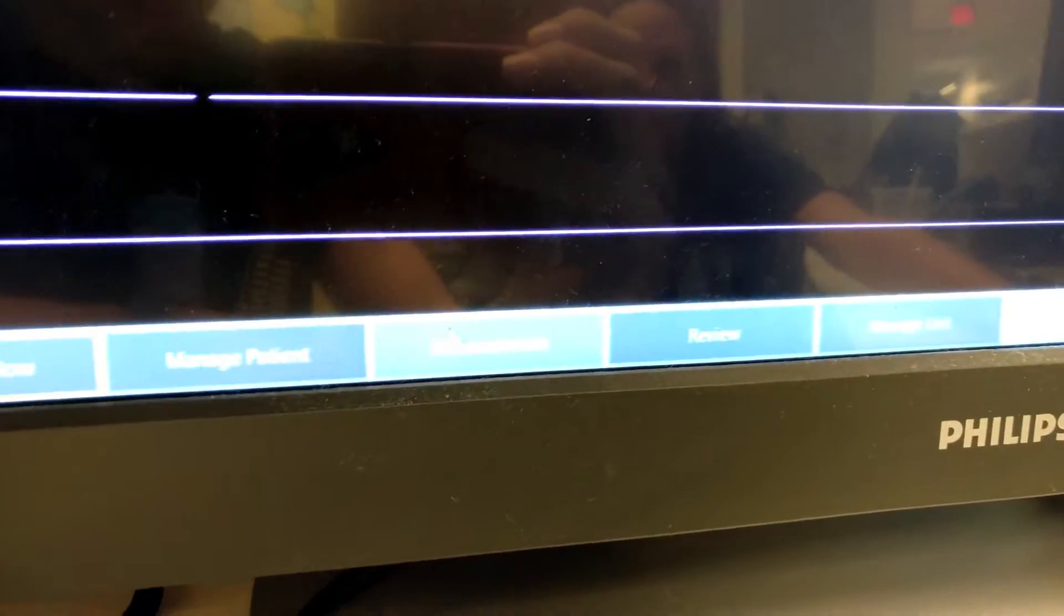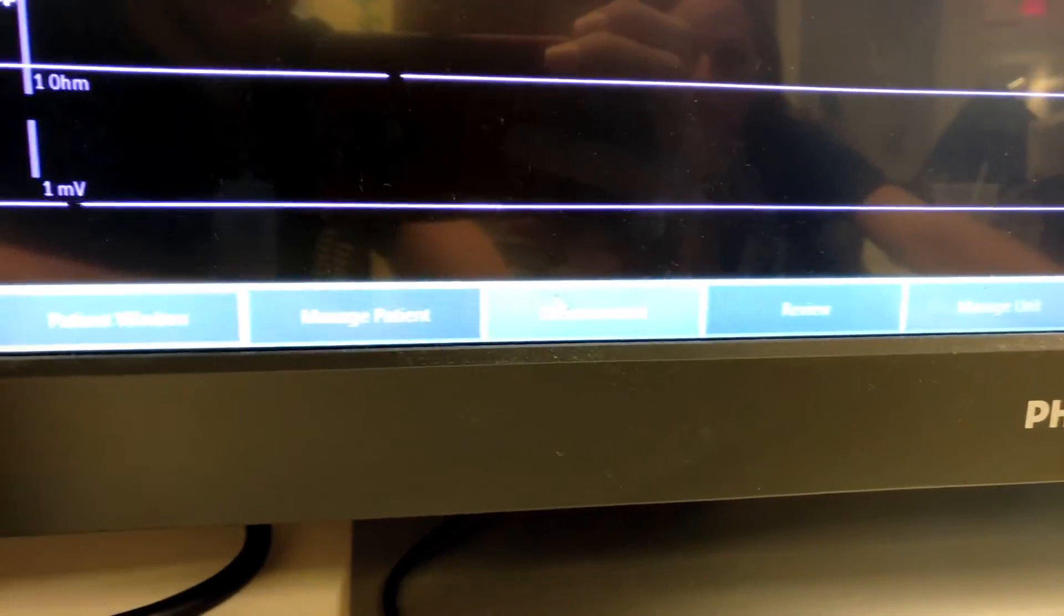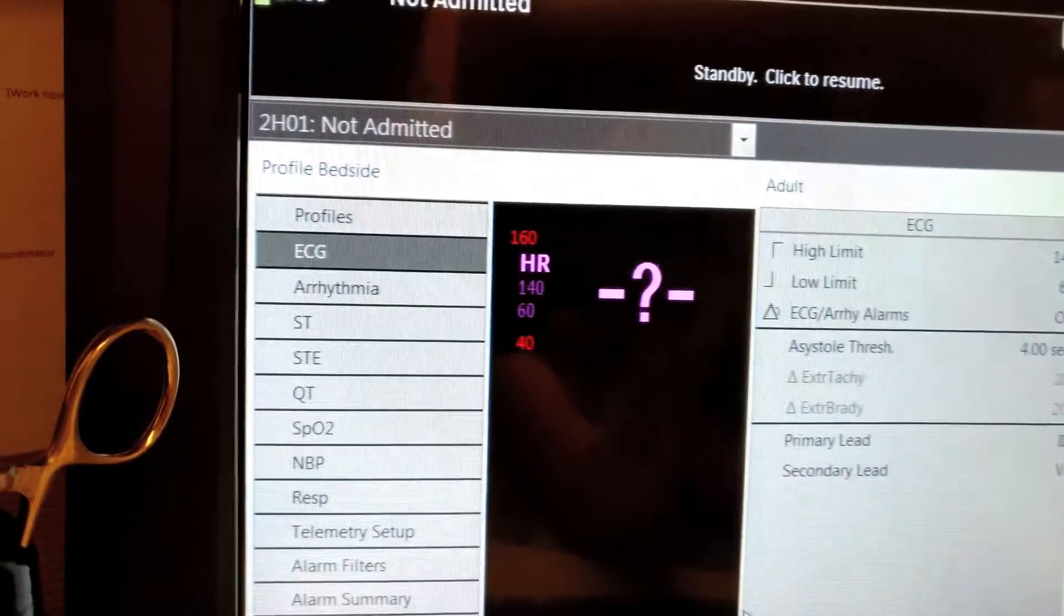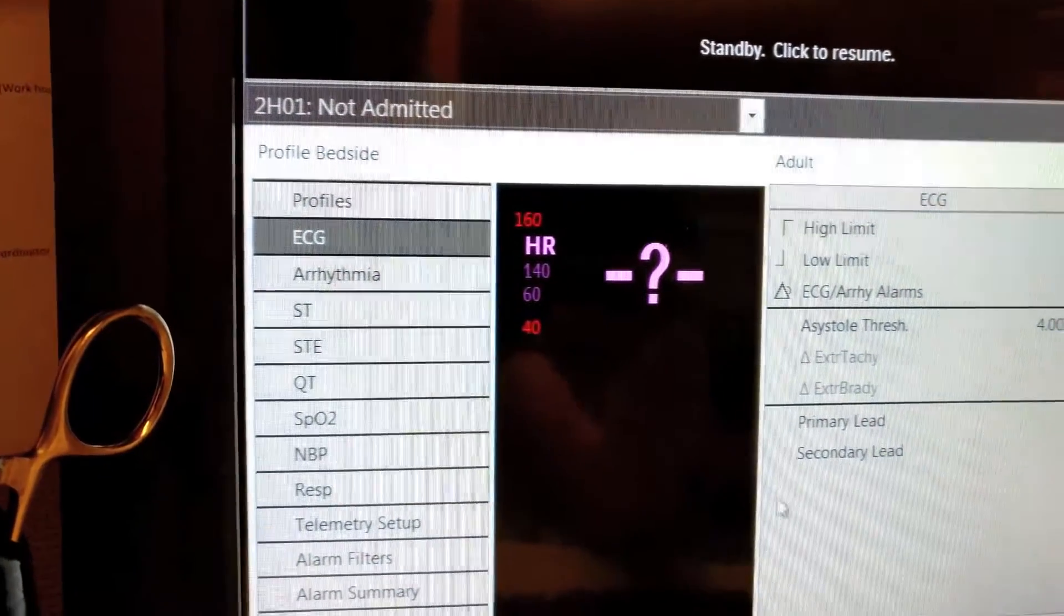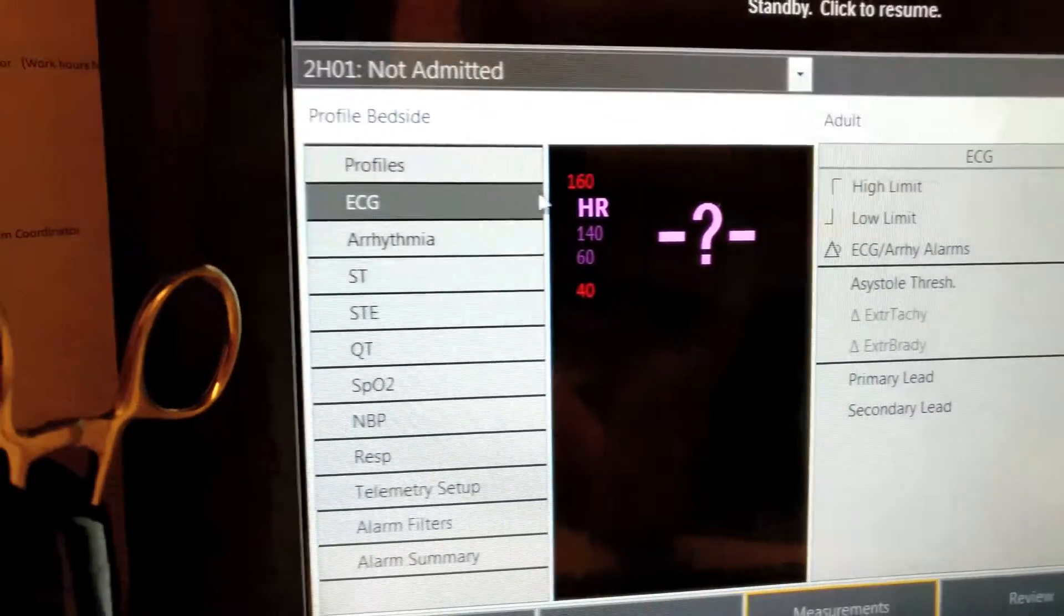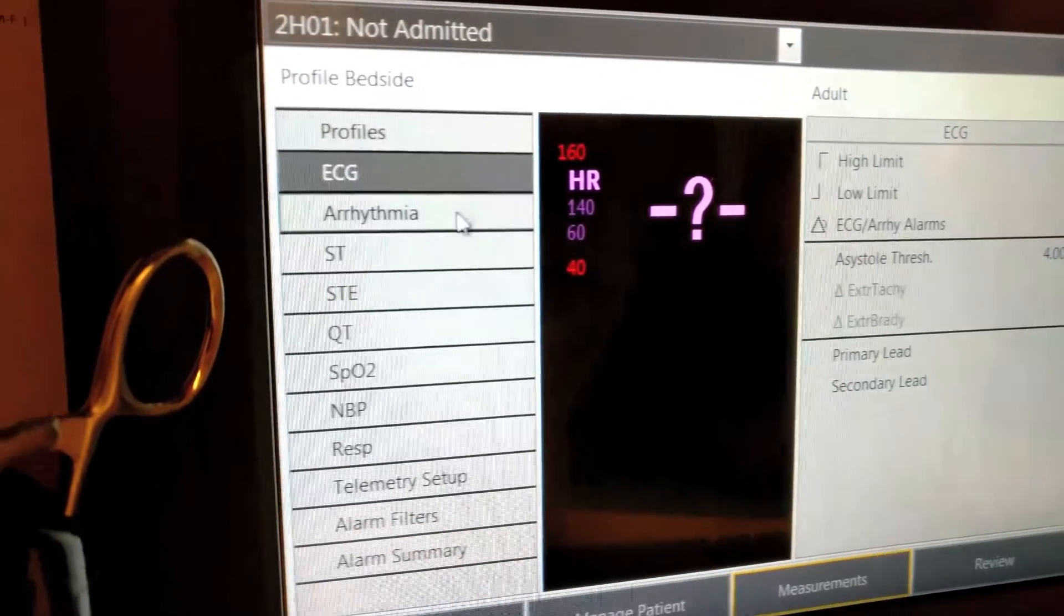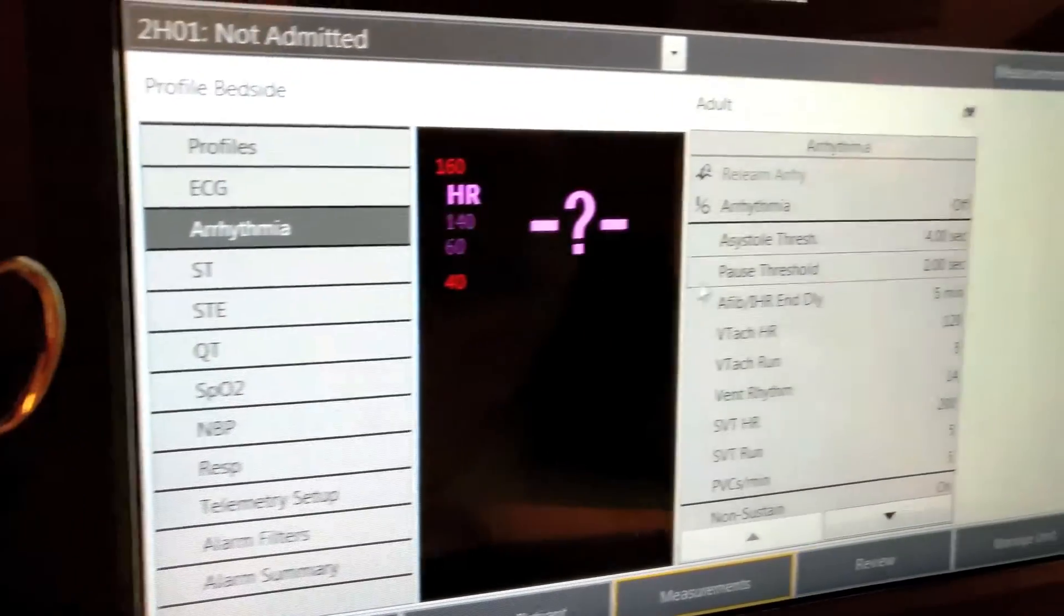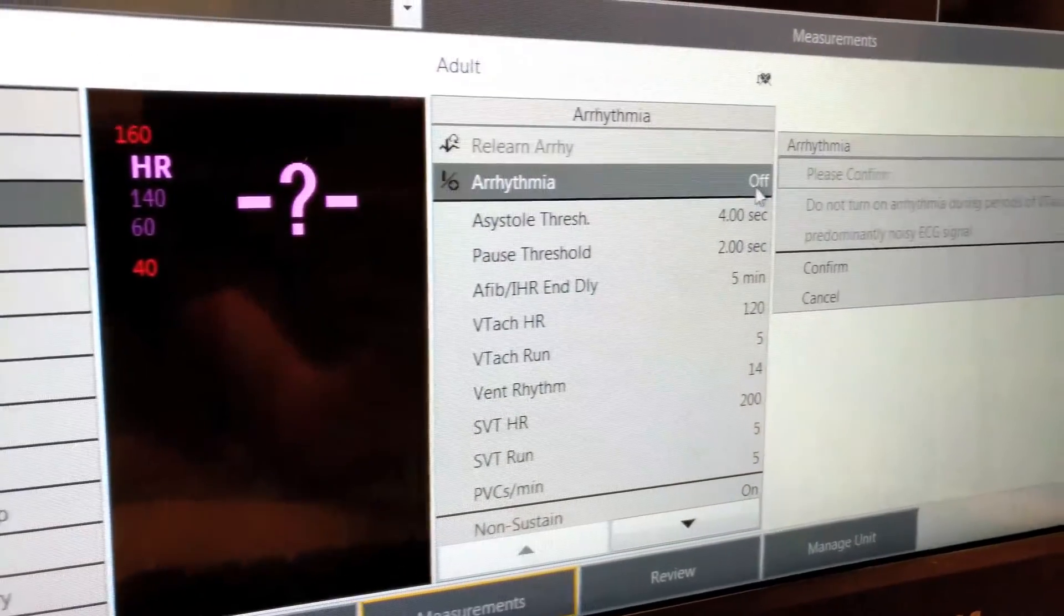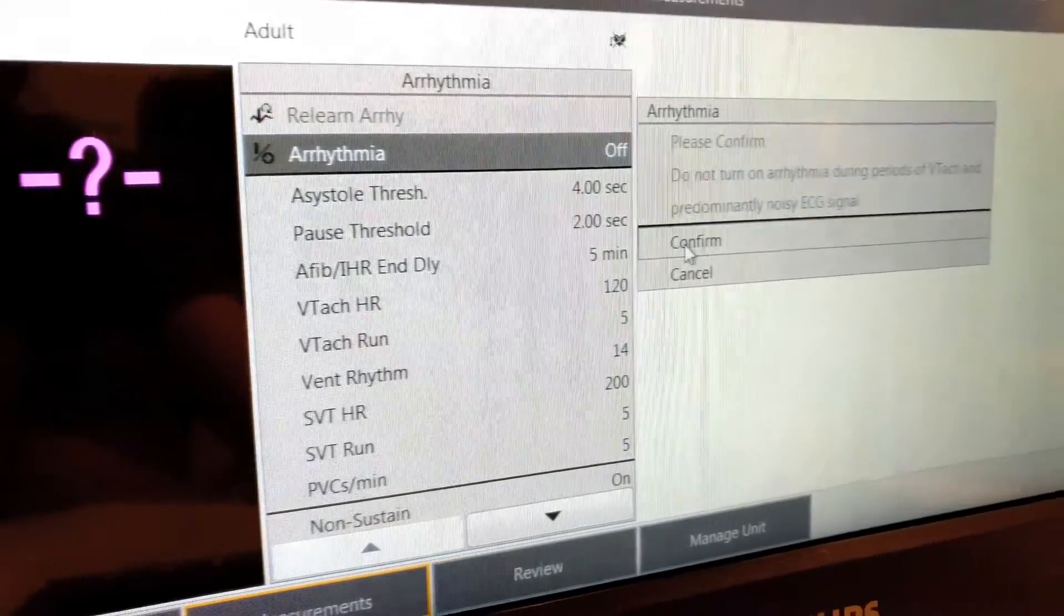To reset your arrhythmia alarms, you want to click the measurements button at the bottom of the screen, then click arrhythmia and then go through the list and make sure all of the appropriate alarms are turned on.